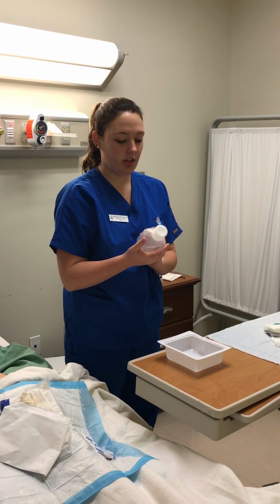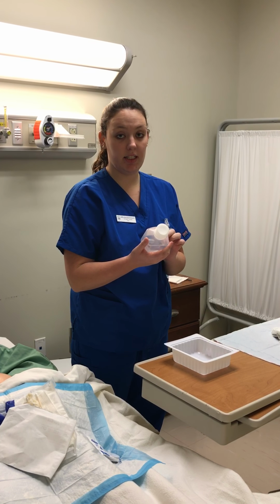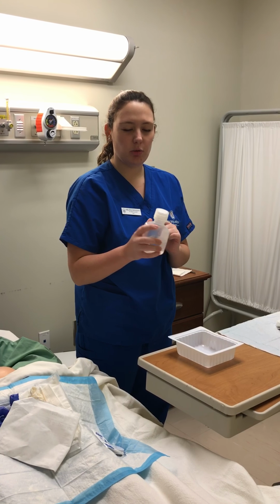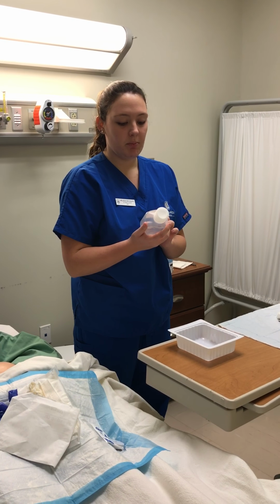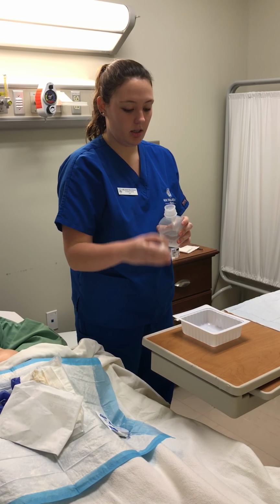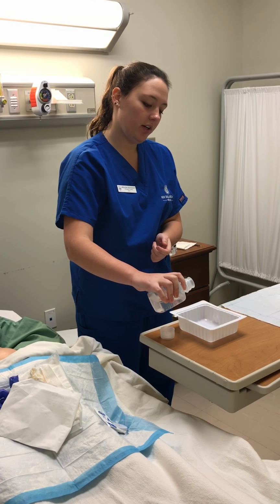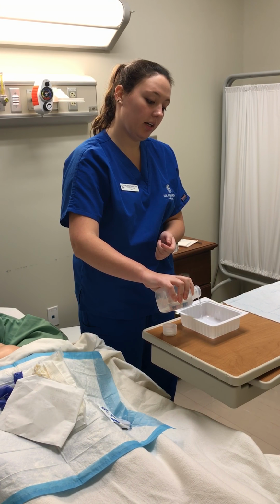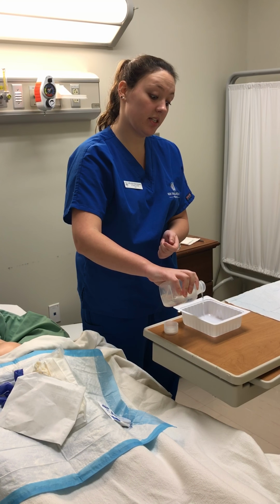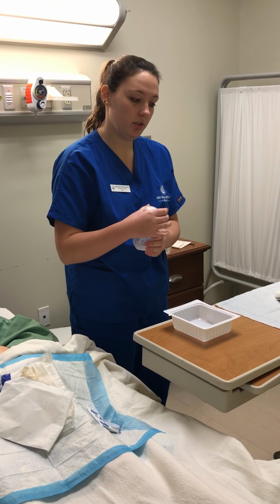I'm going to make sure that if it's not opened, I look to see when the expiration date is and when it was opened. And I also want to lip it before pouring anything in. But since this one hasn't been opened, I can just pour straight from the bottle. I'm going to pour about 4 to 5 inches above, being careful not to splash my sterile field, because that would be a breakage of sterility.